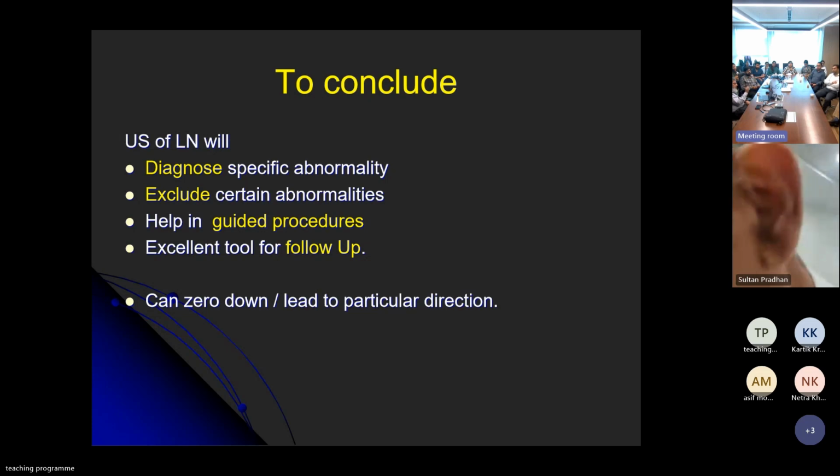Otherwise, picking up a node on a high resolution ultrasound, the image quality would be far superior to anything else. Is it because now you have better quality images compared to the past? Yeah, but that has also helped MR and CT. The imaging has become much better and faster, so the necrosis is picked up on contrast ultrasound, even on CT. In my personal opinion, because we've been picking up so many abnormal nodes, our CT reporting has improved. The reverse has happened in our scenario.